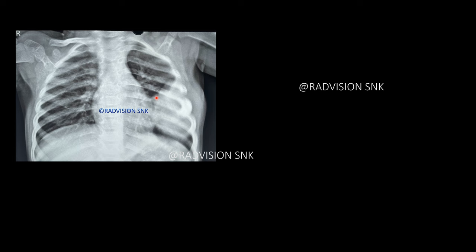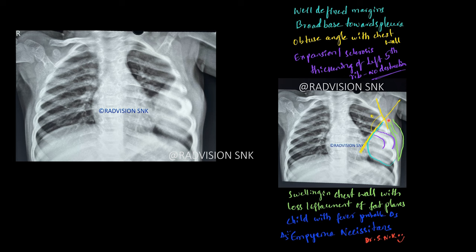Next case: a child presented with fever and swelling in the chest wall. You can see a radiopaque shadow noted against the chest wall with a broad base towards the chest wall, and there is soft tissue swelling within the chest wall. There is typical sclerosis of the left fifth rib — sclerosed with no destruction as such. Drawing a line along the mass and along the rib cage, you can see it forms an obtuse angle. This obtuse angle helps in differentiating this as an extra-pulmonary or pleural-based mass rather than a lung mass.